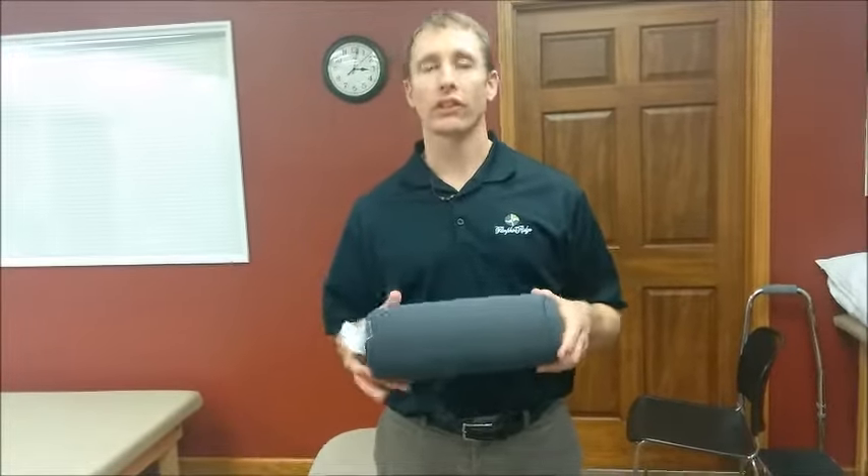also known as the lumbar pillow. The reason this is important is because it can help people who have back pain, it can help prevent back pain, but also we notice that a lot of people are using them incorrectly.